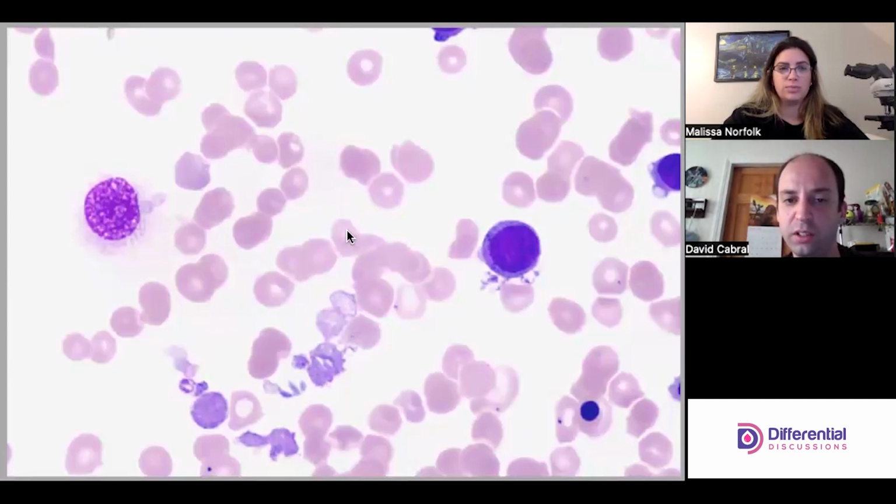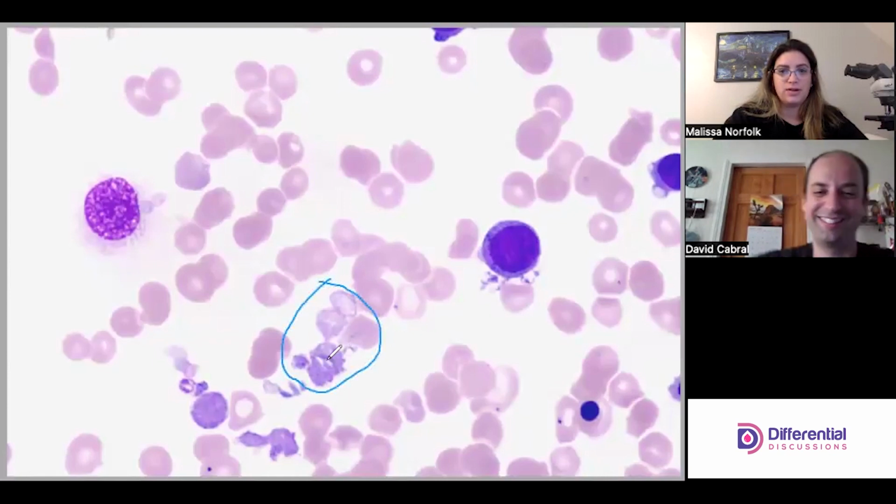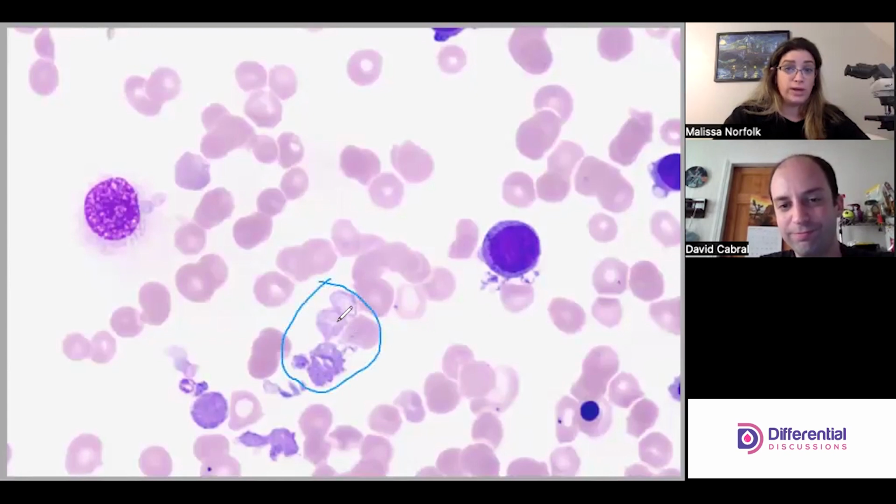Look, usually the platelets are like 2 micrometers. They're very small. But for example, this is a platelet. And you can see, like Dave was saying, this one has granulation over here, but this section's not really quite as granulated. This is way larger than 2 micrometers. Really funky looking. There's lots of pseudopods coming off of it. This one doesn't really have blebs, but there's lots of pseudopods on it and lots of little pieces coming off. It'll just vary, but the platelets are wonky.